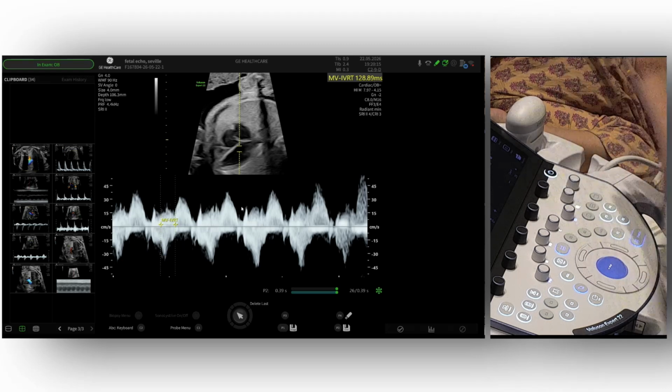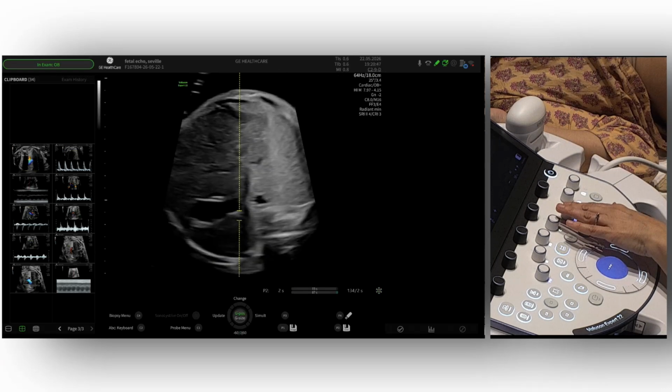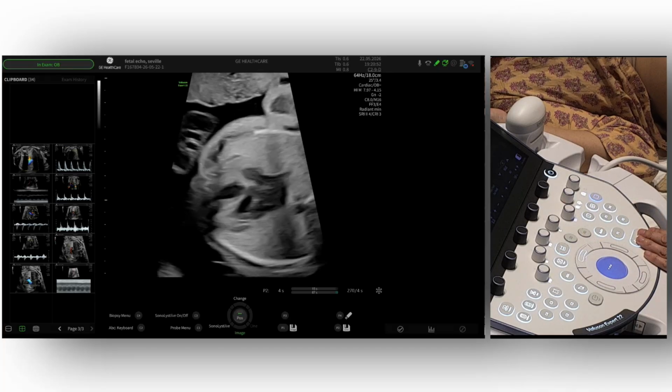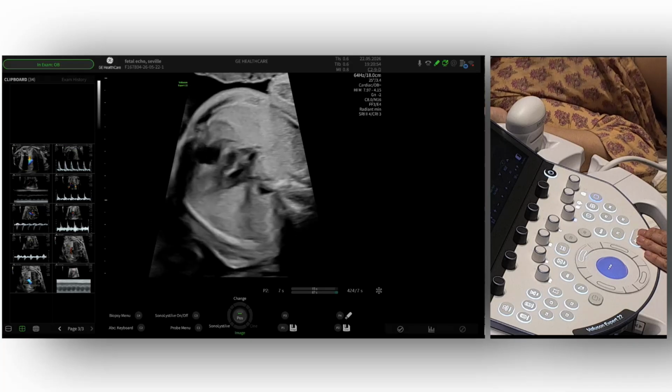Very helpful. That's great, Fatima. Is there anything else you would like to show us? We're coming to the end of scan time, but is there anything else you would like to show us, or are there any questions from the audience?